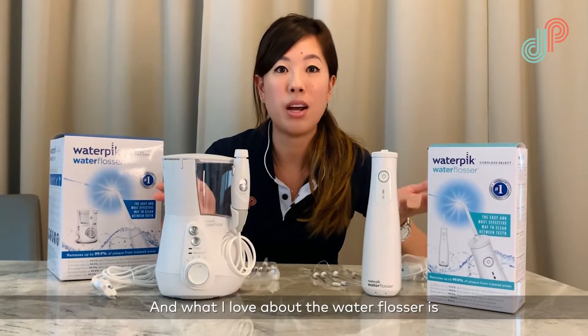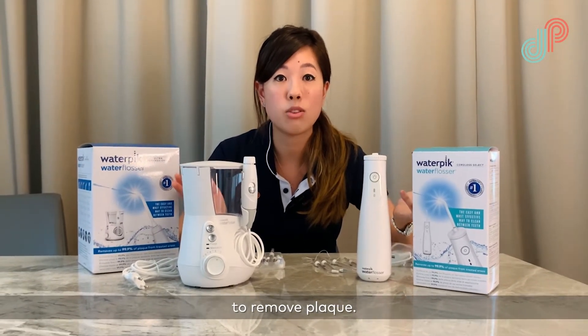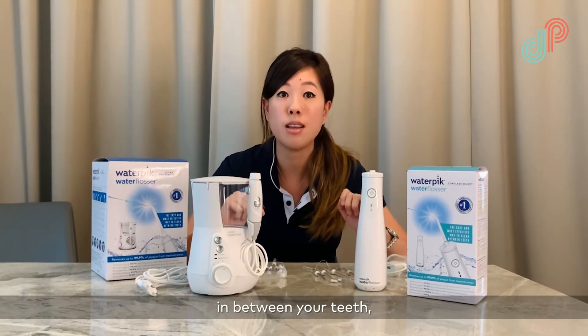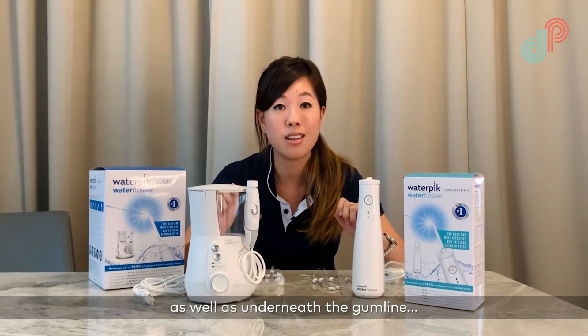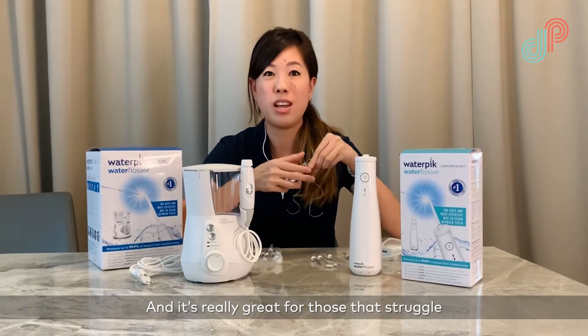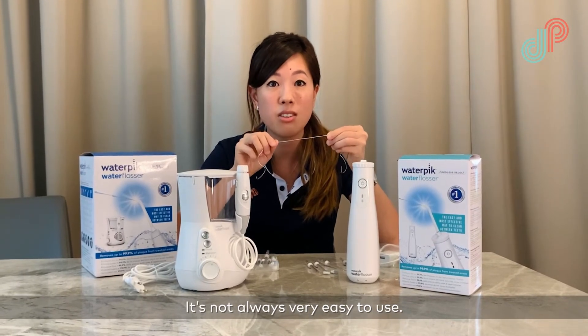What I love about the water flosser is it's a really easy and effective way to remove plaque. It can remove food by spraying water in between your teeth as well as underneath the gum line, and it gives you a really great clean. It's great for those who struggle with traditional floss, which isn't always very easy to use.